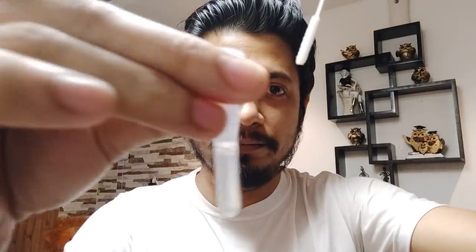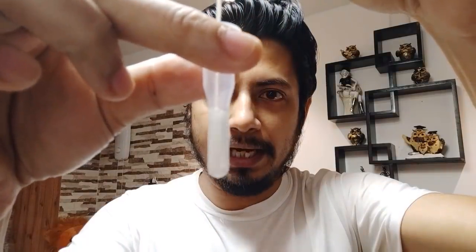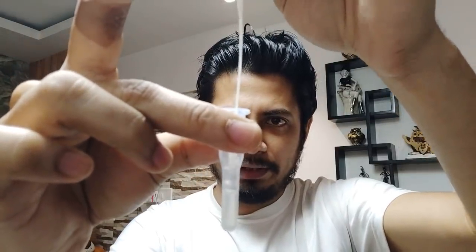When putting it inside, you can use either nostril. Make sure you collect the specimen properly — you need to rotate this brush. Let me show you again. Now rotate it like this — it's done. It's extremely difficult to talk while doing this. I collected enough specimen; now put it inside the specimen tube like this and mix it properly, rotating it about seven to eight times.